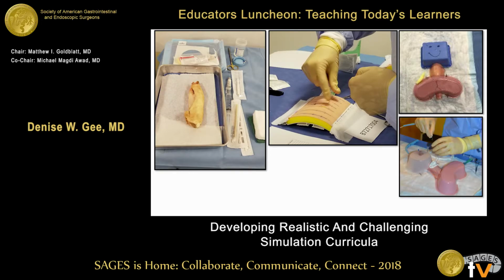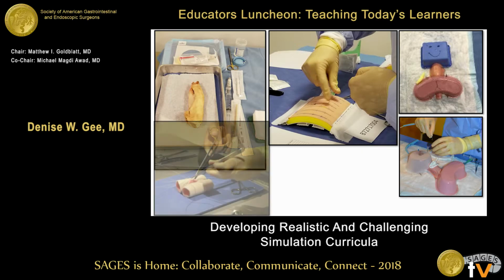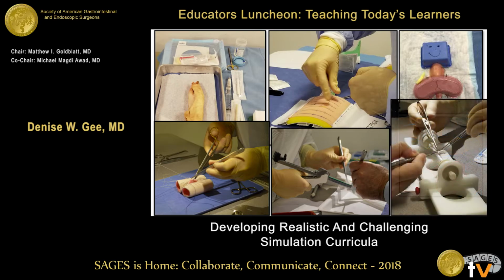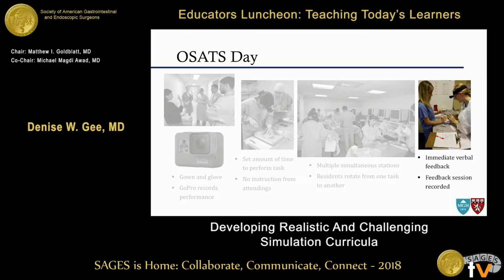Here's a happy model that's about to get an airway. And this is a porcine trachea that our residents are putting a surgical airway into. Hand-sewn bowel anastomosis, stapled bowel anastomosis, vascular anastomosis. So these are all examples.